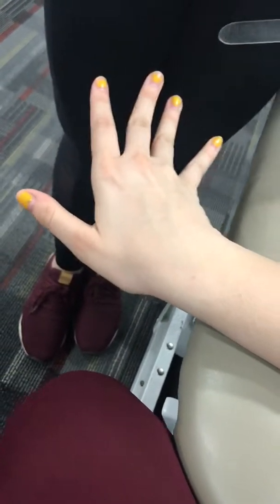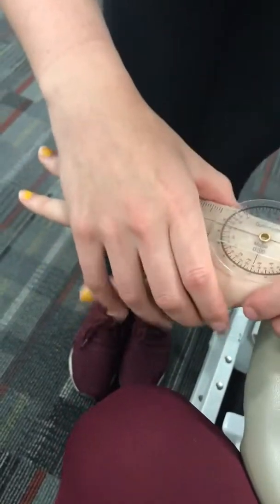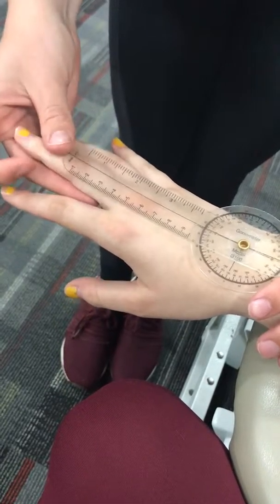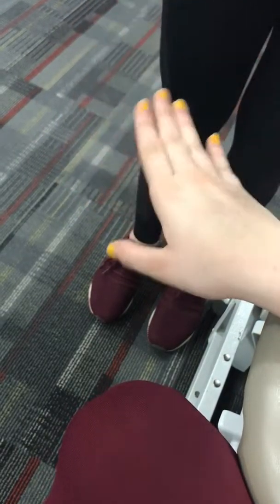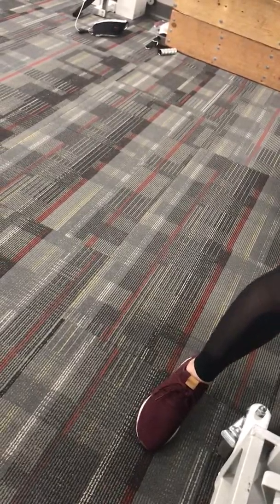Next, active range of motion ulnar deviation. Hand back in the same position — have the patient demonstrate moving their pinky towards the wrist. Place the fulcrum over the middle of the joint line, the stationary arm up the midline of the forearm, and the movement arm over the midline of the third finger. Normal is 35 degrees; she's at about 38, so that's within normal range.